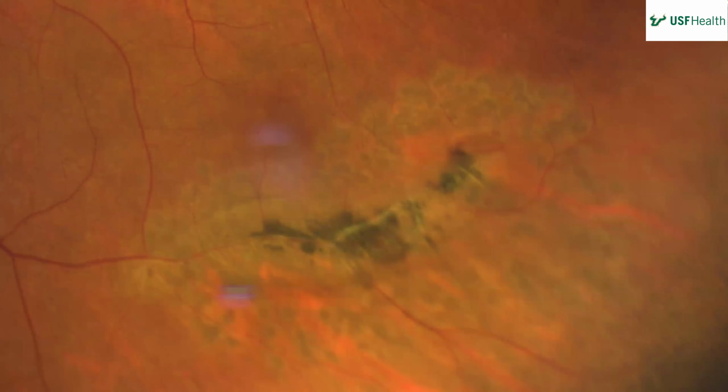And the other thing, I had a call once from a former resident. If you're lasering where I lasered, a little bit away from the tear, and you're not getting takes, and then you go farther out from the tear and you're still not getting any takes, you're like, I'm trying to laser this, but I can't get laser takes. Why is that happening? There's fluid, so that means there's a retinal detachment you're just not seeing. So you just gotta keep marching out. I wouldn't go toward the macula, I would maybe go sideways until you get a take, because it may be just that your settings aren't right.